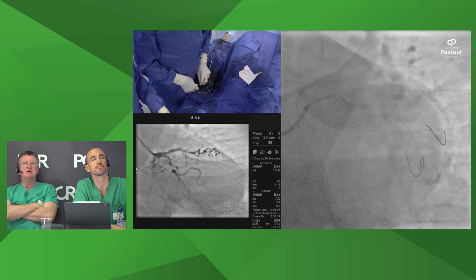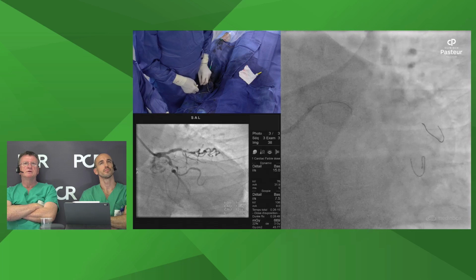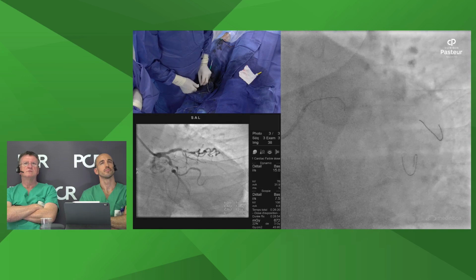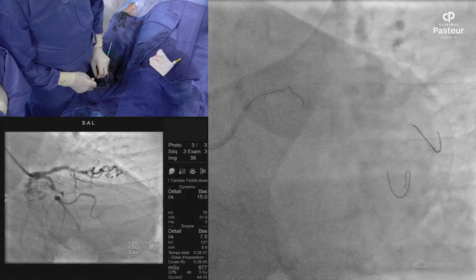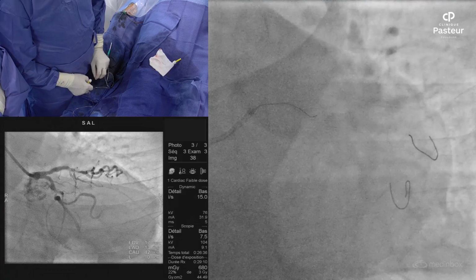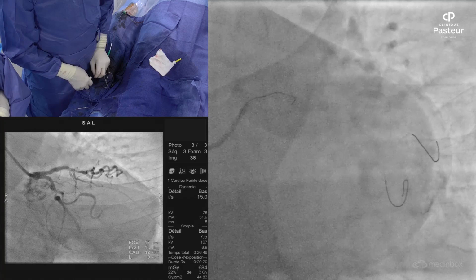It's a matter of the feeling that we have between your fingers when you are manipulating the wire. If you feel some metallic resistance, metallic feeling, with your torque or your fingers, you are certainly through the wire. If you do not feel this, you could be more optimistic to say that you are in. But it's not easy to look at that. Maybe, if I cannot recross, we will leave that like that.